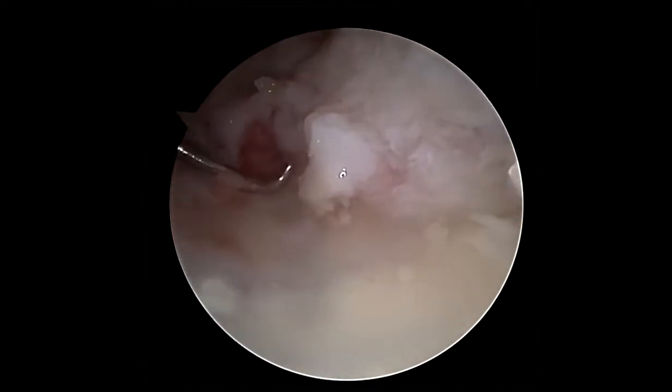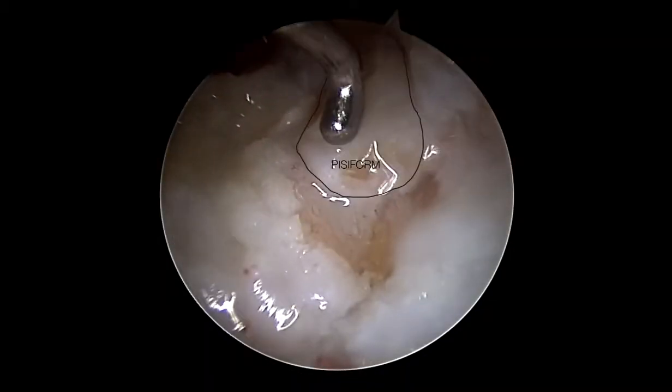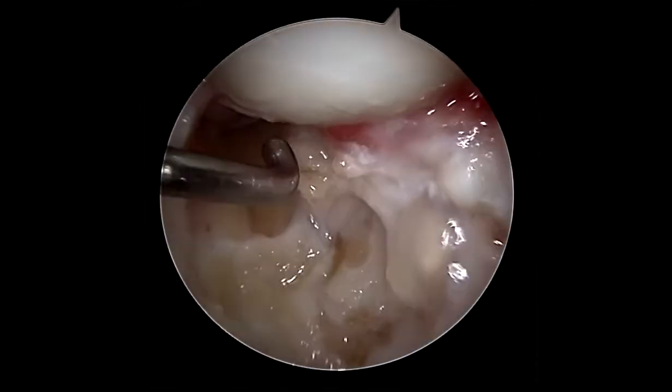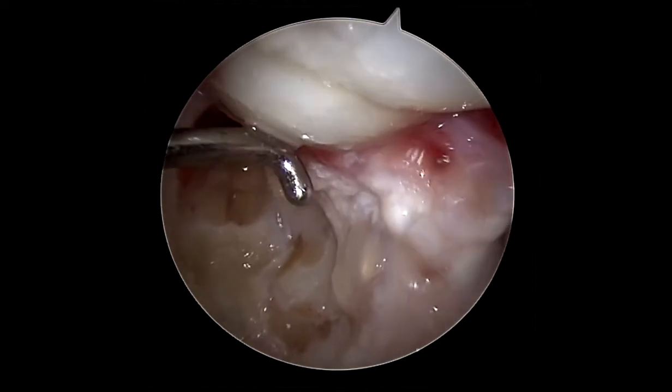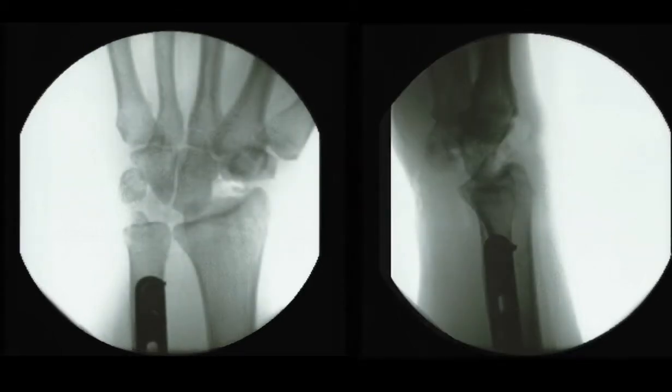The distal radius on the proximal surface and the pisiform and hamate-capitate joint on the ulnar side. The final x-rays are these with traction and without traction.